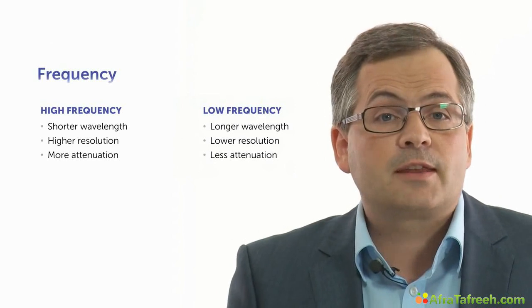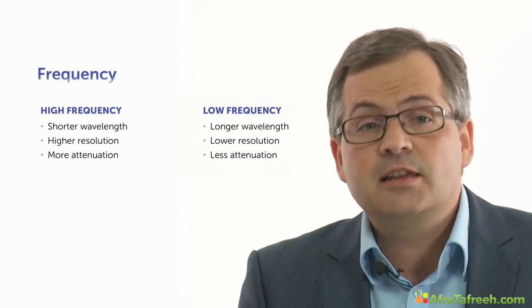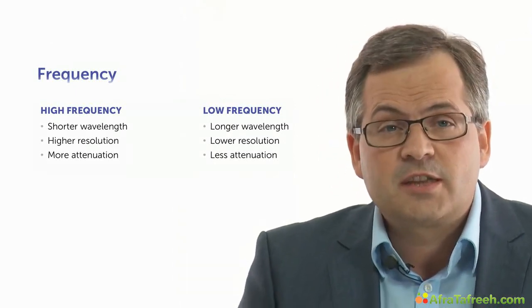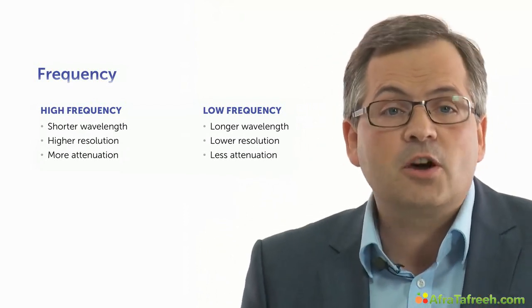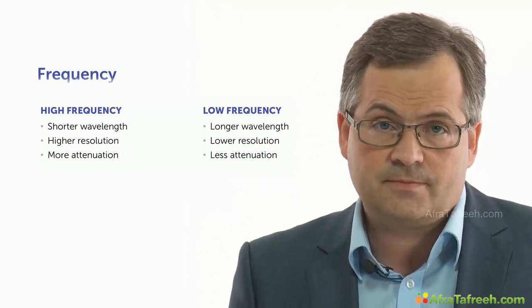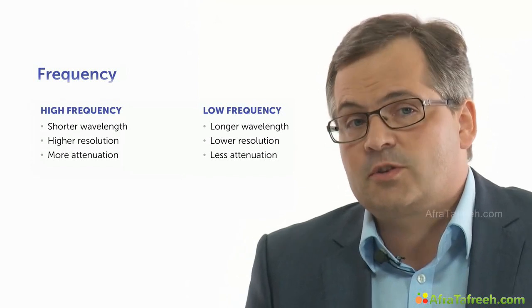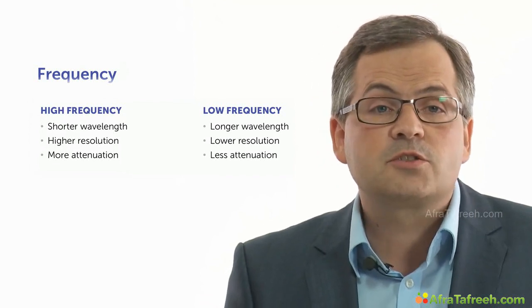We want to achieve as good a resolution as possible. The shorter the wavelengths of the sound waves are, the better the resolution, which means that high frequencies lead to a better resolution. But because the acoustic power of the high-frequency sound waves is more attenuated, they will not reach the very far regions and therefore do not depict deep structures. We have to decide what we are going to examine. When we use high frequency, we will get high resolution, but only in the superficial areas under the skin. But when we want to depict structures in the far field, we have to use low-frequency waves, but they will have less resolution on the screen.